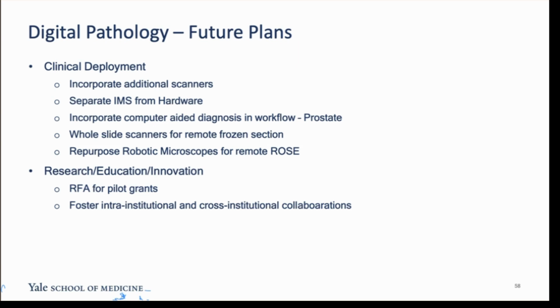And in that sense, there are some solutions out there in the market that have gone through the FDA's approval process, and those are probably the ones that are easiest to deploy. Some of them certainly hold promise for increasing efficiency, for example, detection of lymph node mets. And so I think those are some of the low-hanging fruit.